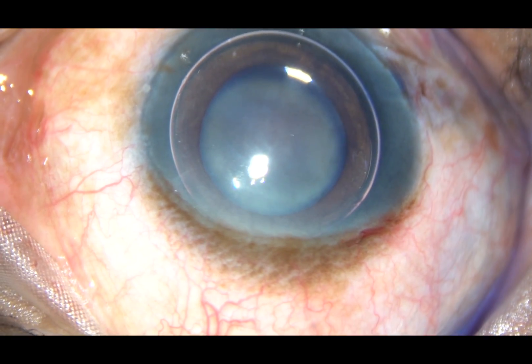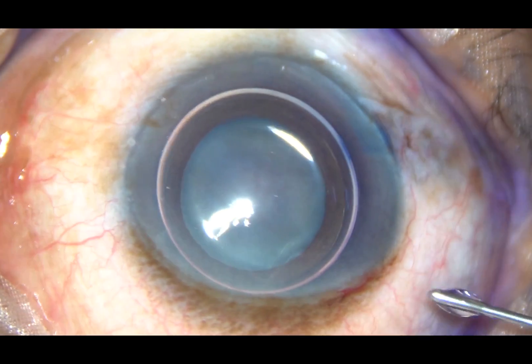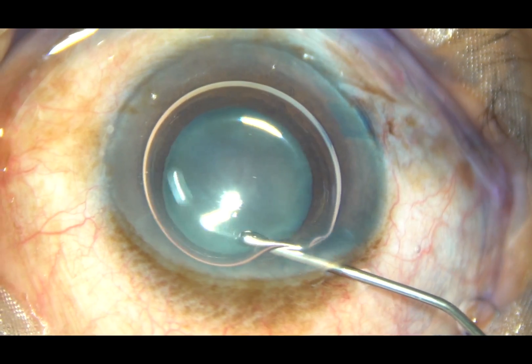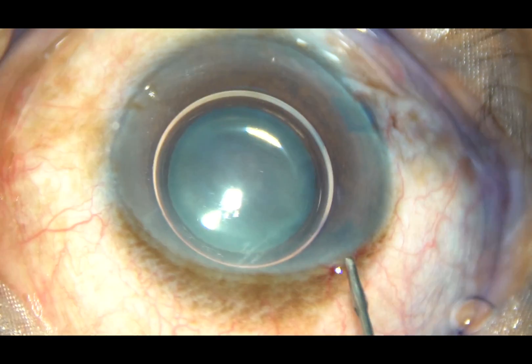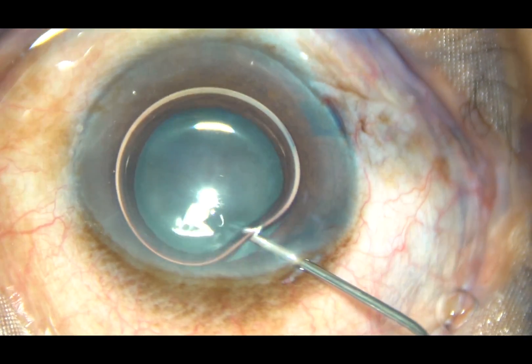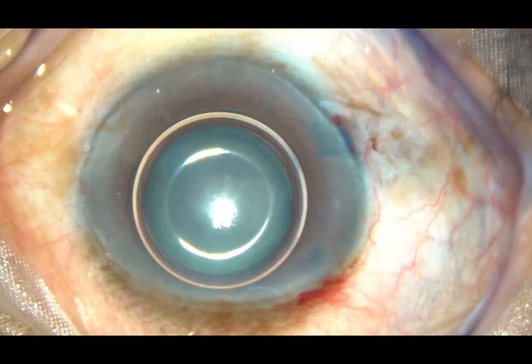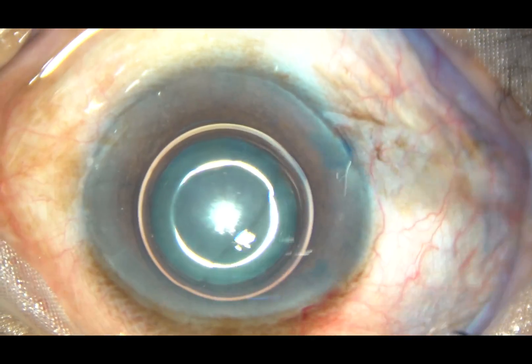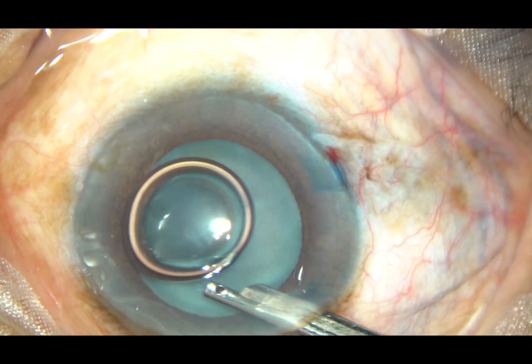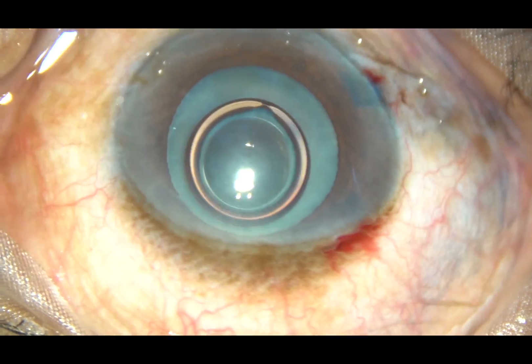There should not be skipped areas. Now, this is a bit of adrenaline. The pupil is dilated quite well, but it may get small during surgery. So I am using some amount of adrenaline, which is preservative-free. This may help in surgery. Now the dye is washed out. Enough staining has occurred within this very short period of 10–12 seconds.